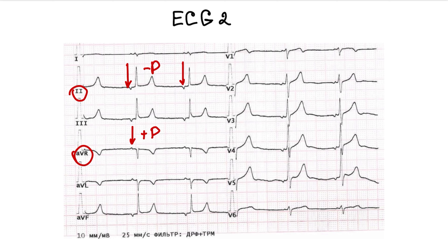The p-wave is consistent within the same lead and still precedes the QRS complex, indicating that the atria are being activated before the ventricles. This means that the rhythm source is in the atrium, but the p-wave is not typical for sinus rhythm. There is a clear relationship between the p-wave and QRS complex. The QRS complex is narrow and not deformed. The rhythm is regular. This is an atrial rhythm.